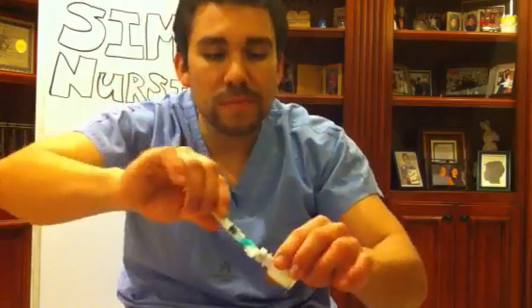Push the medication into your patient. It's really just mechanics. Grab an orange and practice — do it at least 10 times before clinicals. Z-track method: dart in, pull back, push. Do it again. You do not want to be in clinical with the patient and instructor looking at you and fumble through it. You want to be smooth: boom, grab, pull, push.